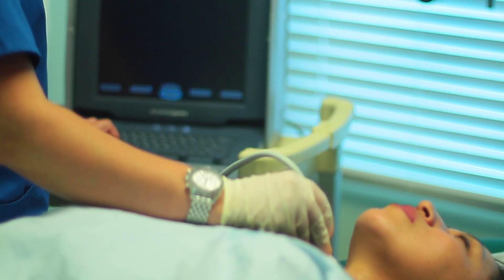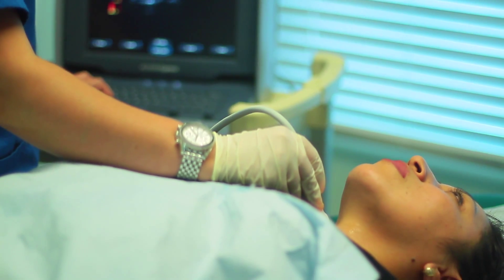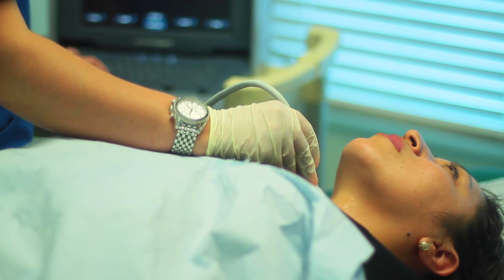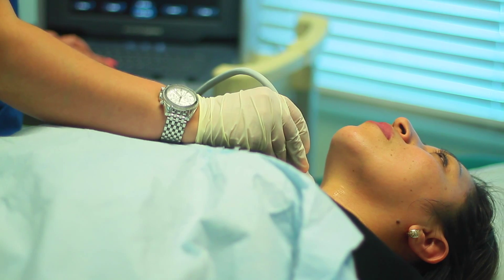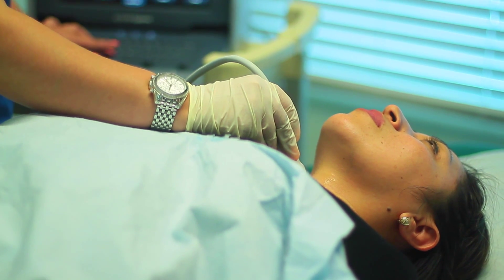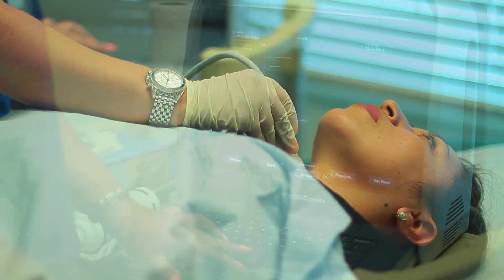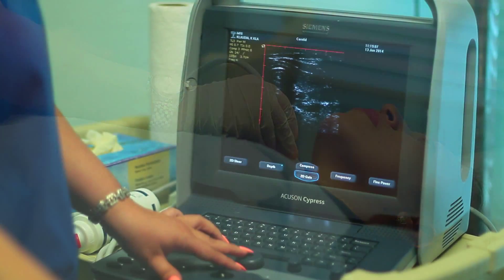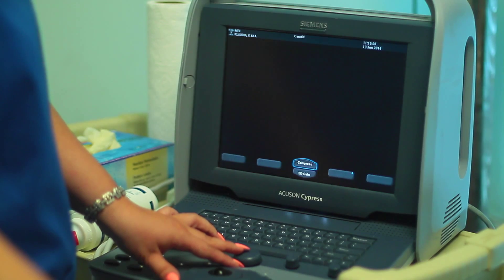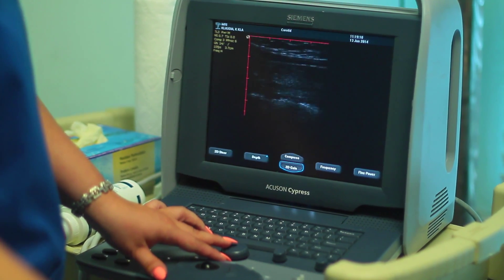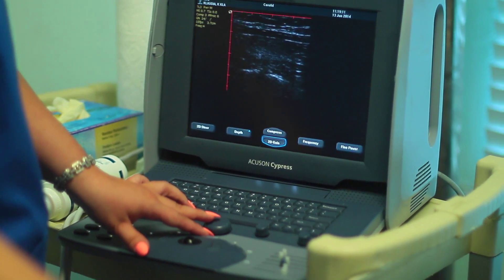We use the ultrasound device to evaluate the location and characteristics of palpable neck masses that a general practitioner may feel during routine physical exam.